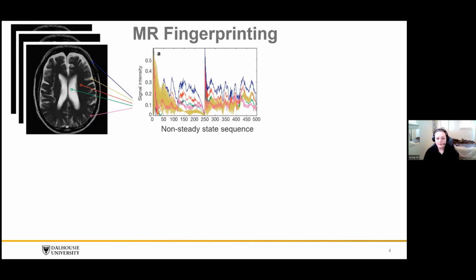And so when looking for an initial sequence to base this research on, MR fingerprinting immediately jumped out to us, as it is known for providing multiple parameter maps within a single scan. MR fingerprinting was a hot topic in the MRI community about 5 years ago. But for those of you unfamiliar, unlike a traditional MRI sequence, which seeks to drive the system into a steady state, MRF lets magnetization evolve with time, resulting in data being a series of voxels with a rapidly changing signal.